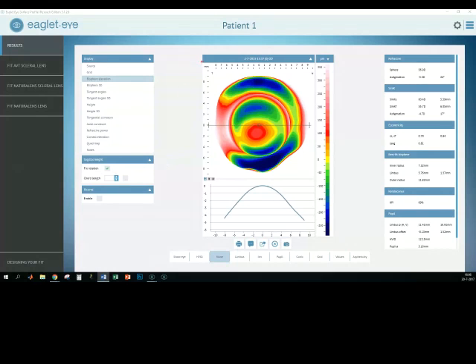First of all, you can see that we have a measurement which is 18, 19 millimeters. And also in the vertical direction, we have a measurement of 18 millimeters. So that's pretty good. And now you're looking at this map.